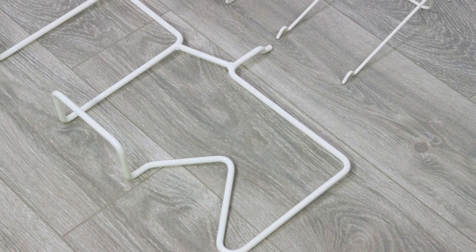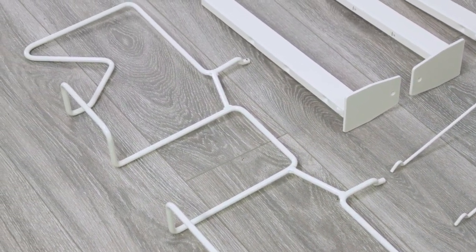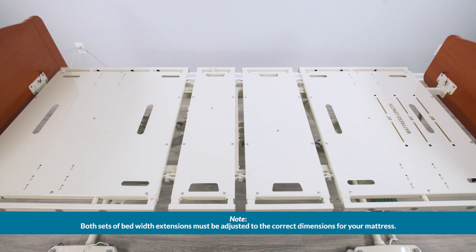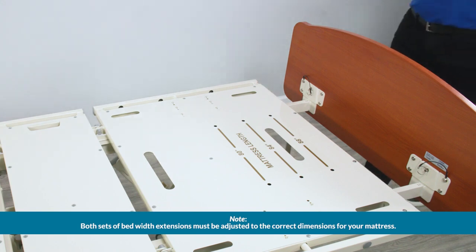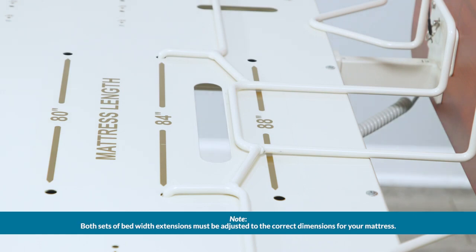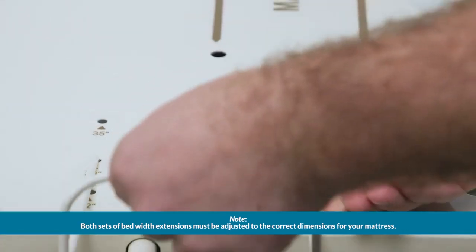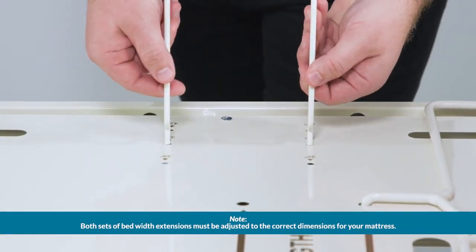Next are the mattress retainers. The mattress retainers are designed to keep the mattress on the sleep surface. The length mattress retainer can be set at 80, 84, or 88 inches and the width mattress retainers can be set at 35, 39, or 42 inches. Locate the mounting holes in the bed deck. Place the length mattress retainer on the bottom end of the bed at the appropriate setting for your mattress. Insert the width mattress retainers in the correct setting for your mattress. Repeat on the other side of the bed.